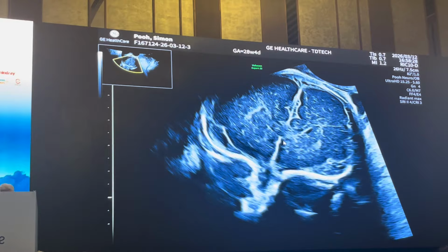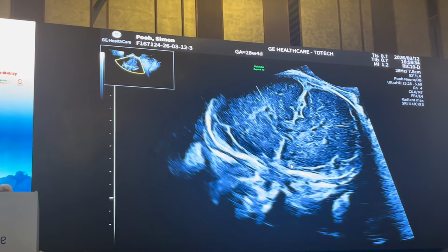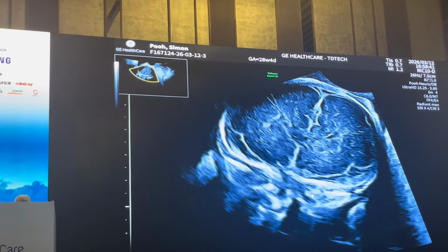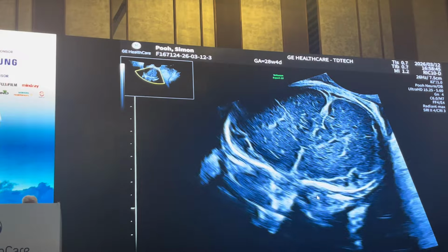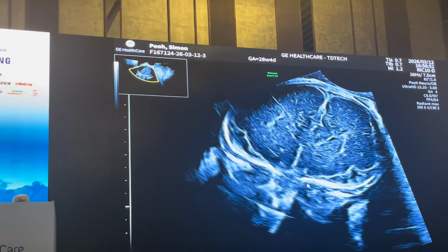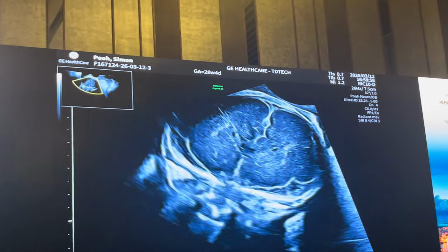And in terms of the olfactory tracts, if you can show us how you look at those in real time? The real time here. This one and this one. So you come up from the orbits, come back from the orbits, and then see. Right. Okay. And so far there are no reports on the measurement of the olfactory tract. So we are now measuring the olfactory in the protocol. But in this case, it might be normal. Yeah. Okay. That's okay.